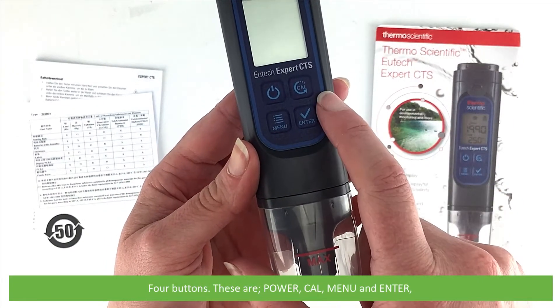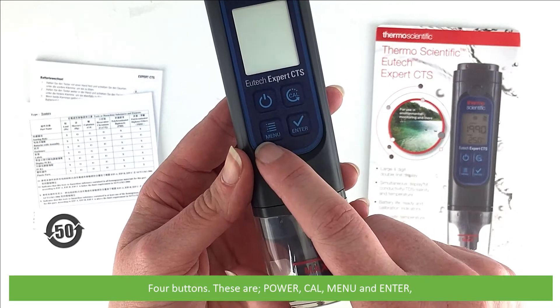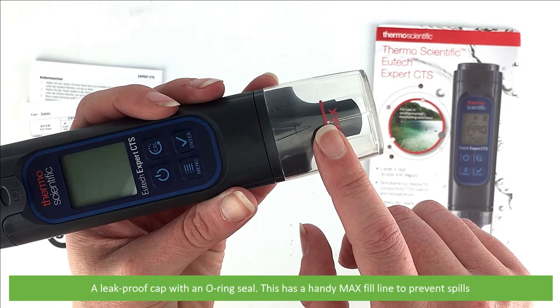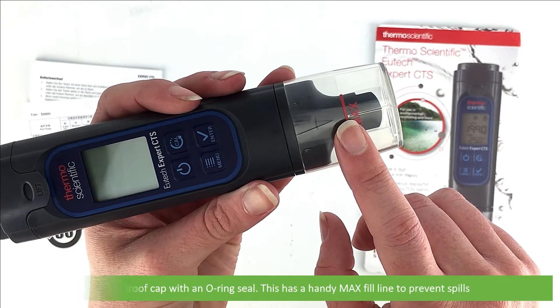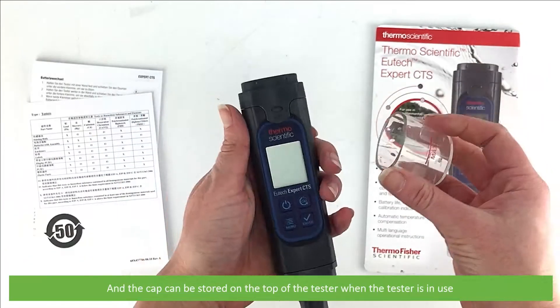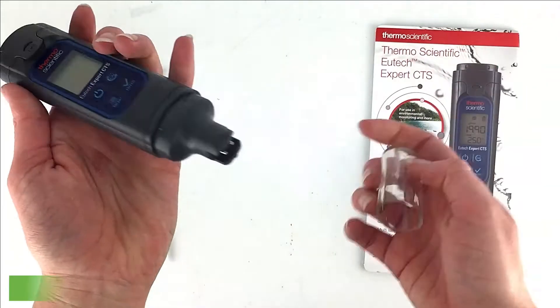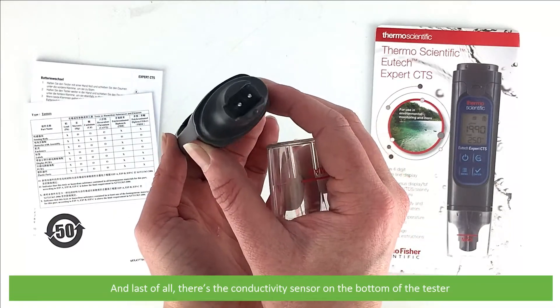There are four buttons: power, calibrate, menu and enter. A leak proof cap with an o-ring seal has a handy max fill line to prevent any spills when taking a measurement. The cap can be stored on the top of the tester when in use. The conductivity sensor is located on the bottom of the tester.